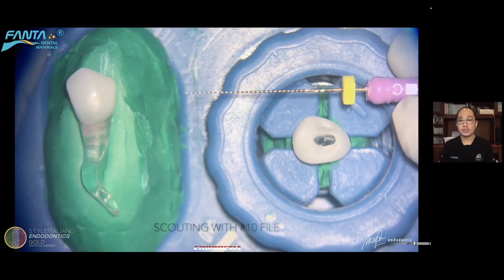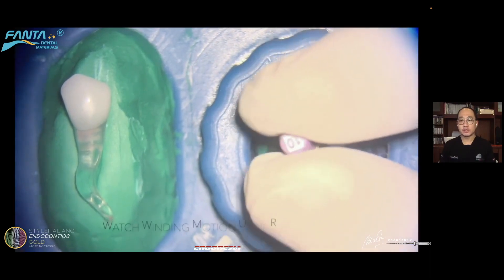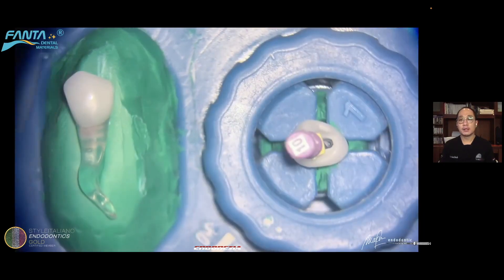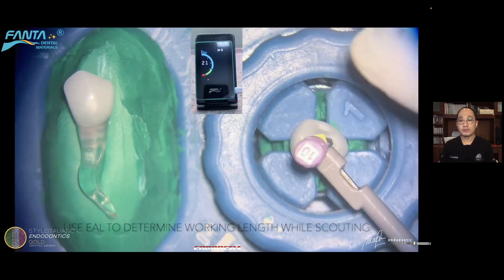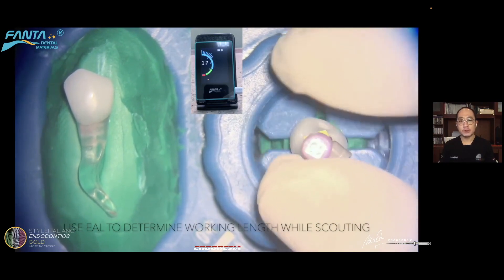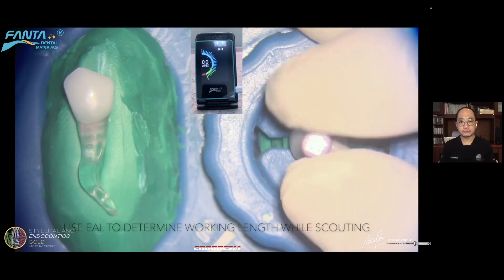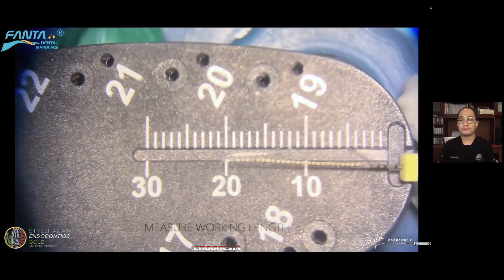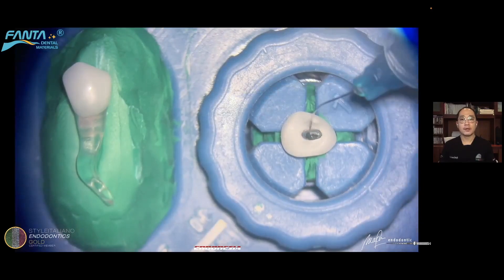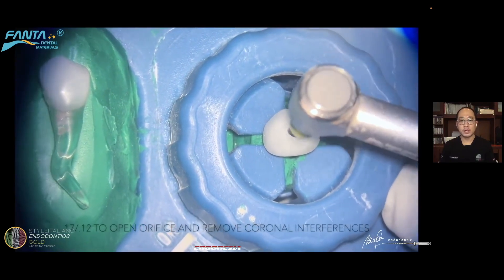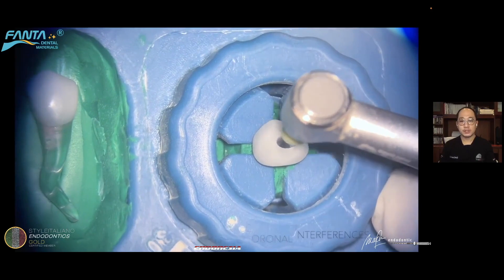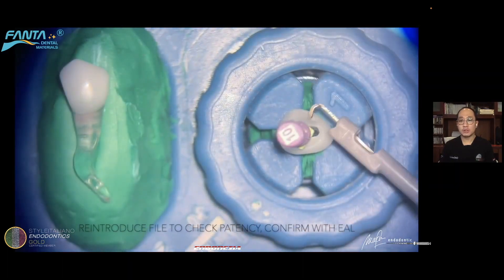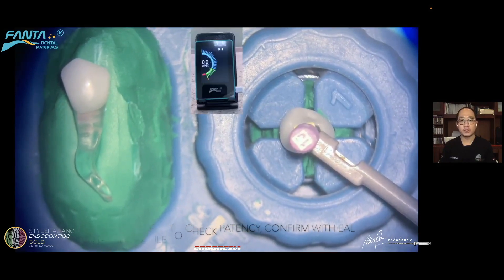Here is a simulation of how to manage dilacerations. First, scout the root canal with a K-file using watch-winding motions until you feel resistance. If a number 10 K-file has too much resistance, go with a smaller size. Confirm with your apex locator that you are reaching the apex, then lower the rubber stop and measure your working length. After establishing working length, perform coronal enlargement to remove coronal interference using the Fanta AF Blue S1 tip 17 taper 12%. Then re-introduce your K-file and confirm patency to working length with the apex locator.